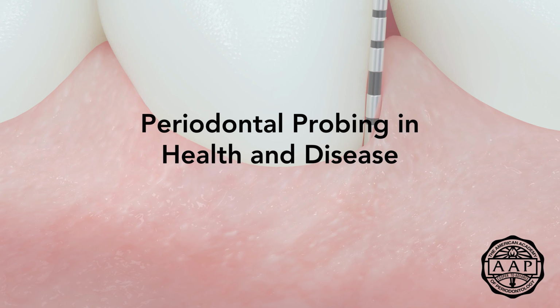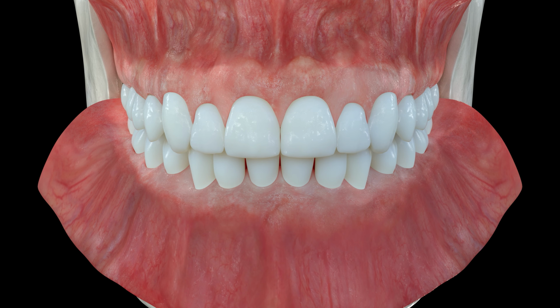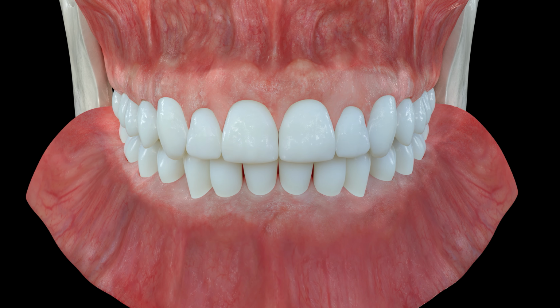Periodontal probing in health and disease. This animation will demonstrate the step-by-step process of periodontal probing in both healthy and diseased periodontal pockets.